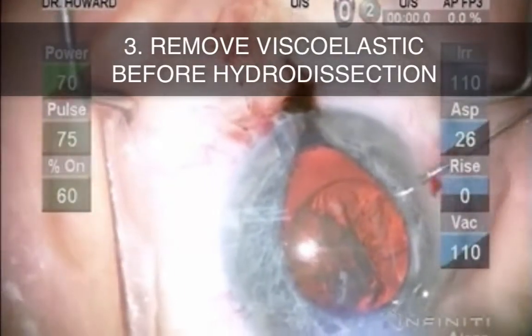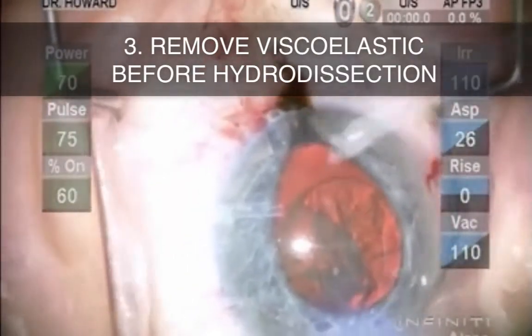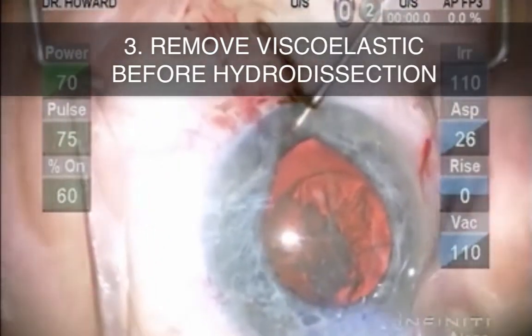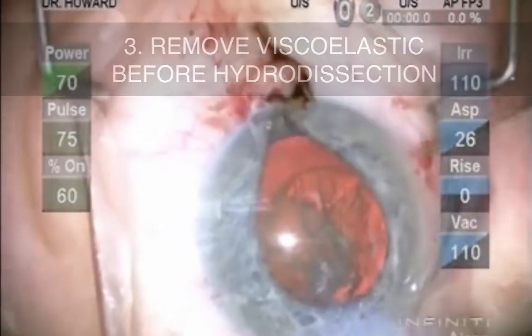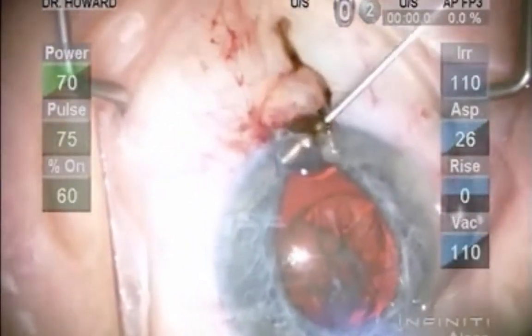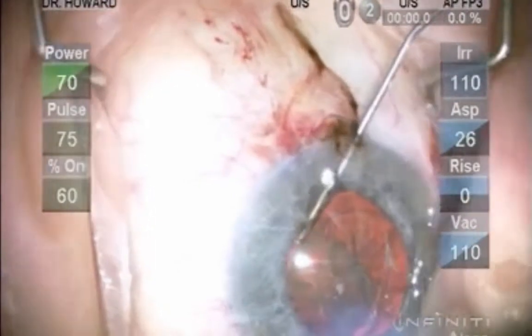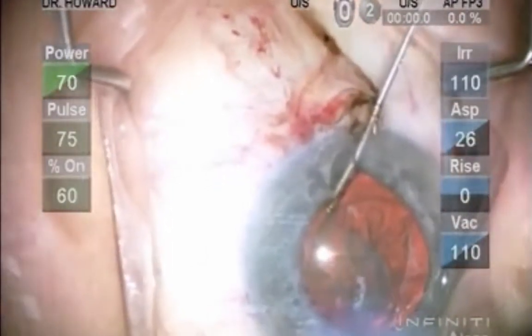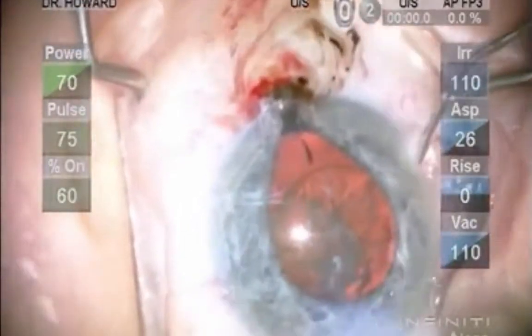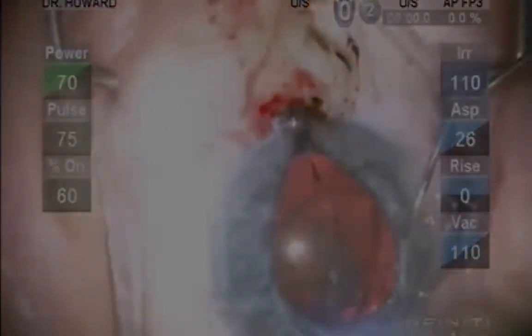Tip number three is to remove excessive viscoelastic before hydrodissection. This video shows a resident surgeon treating iris prolapse by removing viscoelastic from the AC, but the same principle applies to preventing iris prolapse. Hydrodissection poses the greatest risk of prolapse, and taking measures to prophylactically lower the anterior chamber pressure by removing viscoelastic is critical in this prevention.